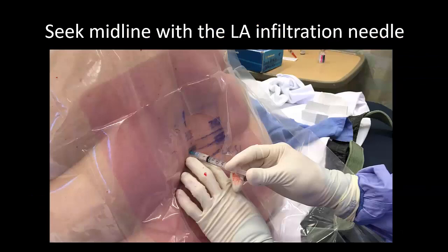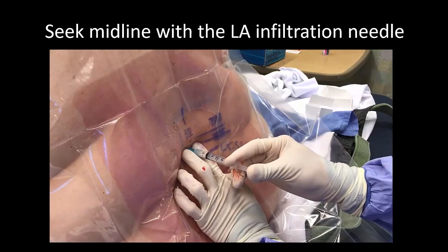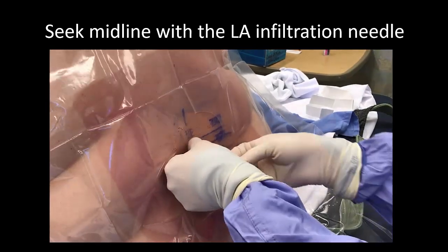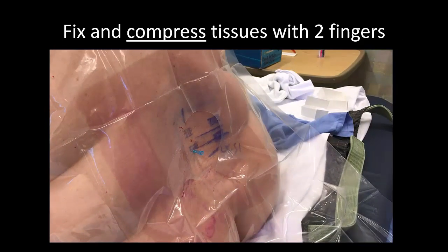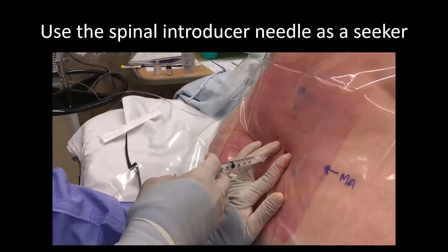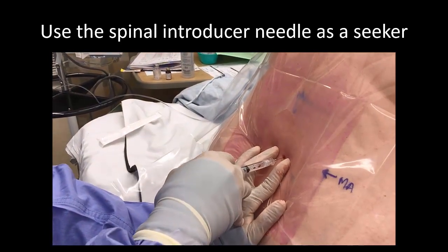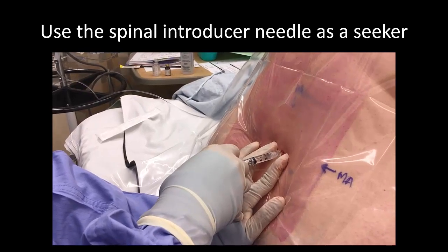An additional advantage of the two-finger palpation technique is that it can be used to compress the tissues, and in all but the very obese, the tip of the spinous process or the supraspinous ligament can be engaged with a 1.5-inch or 4-centimeter infiltration needle. Many longer, small-gauge spinal needles come with their own introducer. If this has a luer lock hub, take advantage of this to attach a syringe and seek the same resistance to fluid injection that comes with placing the needle into the interspinous ligament.